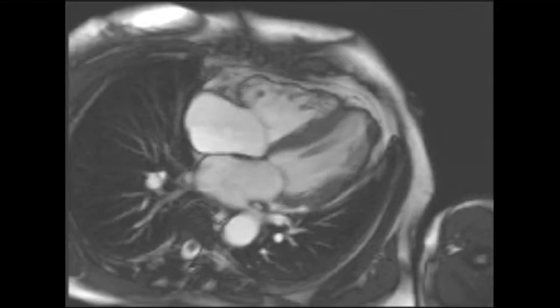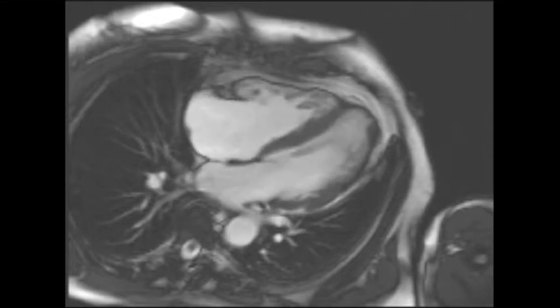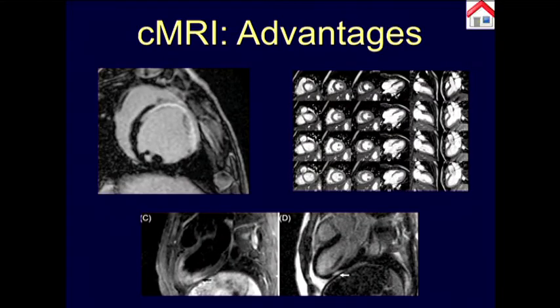Dysplasia. This patient has aneurysms in the basis, particularly in the middle third and in the anterior apex. And not just dysplasia or aneurysm in the right ventricle, but there are also aneurysms in the left ventricle. This wall is not contracting properly. This wall is not contracting properly either. And this was initially described in Italy. Late enhancement has a diffuse scatter of dysplasia in the right ventricle, a relatively easy diagnosis to make.